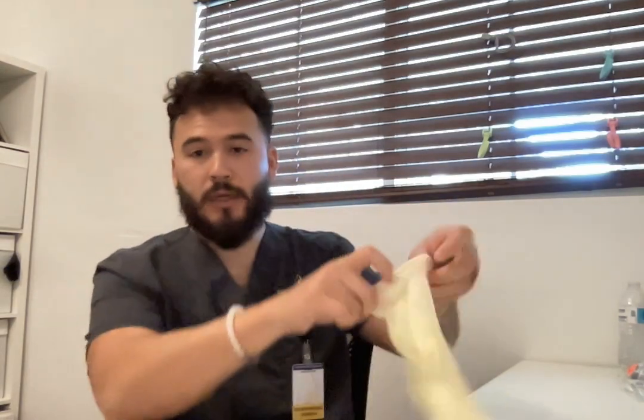Okay, so now we're going to start. So I'm going to knock on the door and introduce myself to the patient. I am going to identify the patient with 2 identifiers, provide privacy. I want to make sure that I check the patient for allergies, and then whatever they tell me, I want to confirm in the chart, just to verify the information that they're giving me. Then I'm also going to perform hand hygiene, and once I do that, I'm going to put on my gloves.